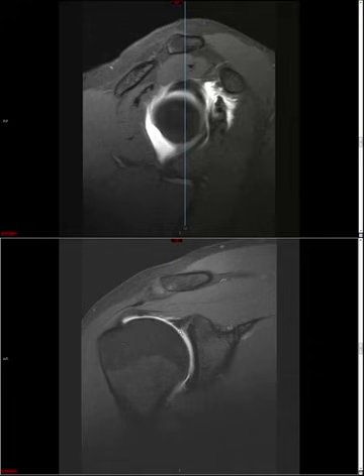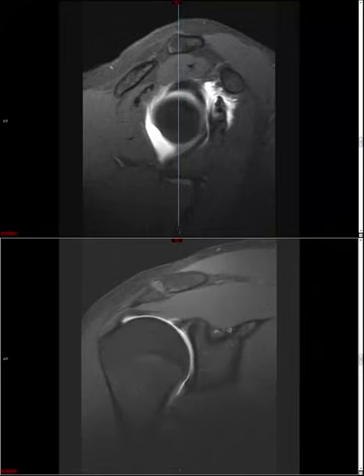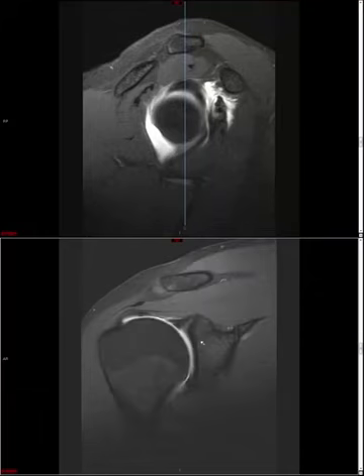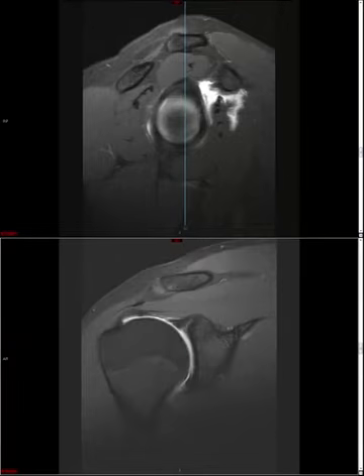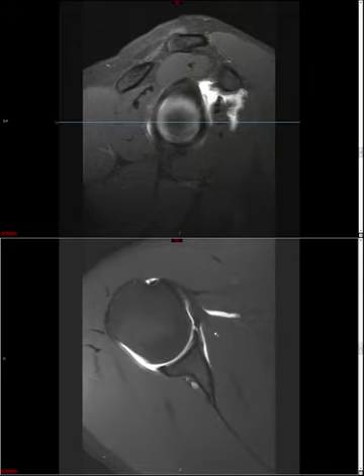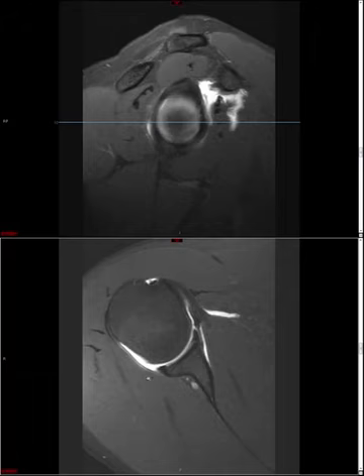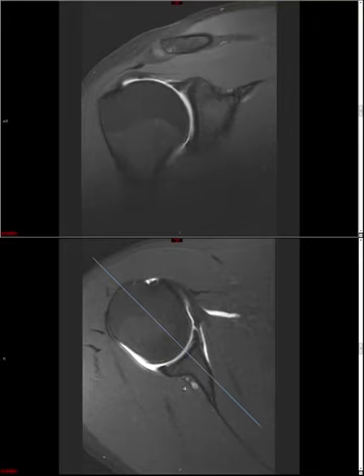Signs of a true labral tear include high signal that curves away from the glenoid or goes straight up, changes in thickness as you scroll, or thickness greater than 2 millimeters. Just as with the knee meniscus, we go through the entire labrum on axials and coronals, noting tears while being mindful of these normal variants. If you do see a labral tear, just as with a meniscal tear, check for a paralabral cyst.